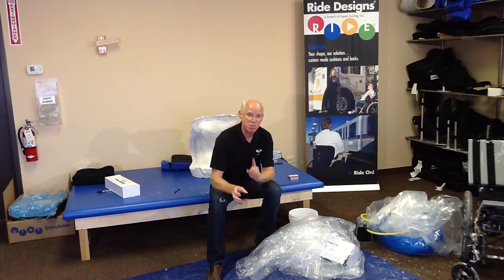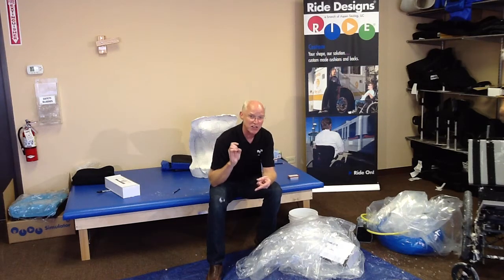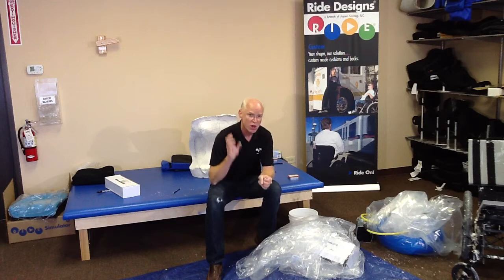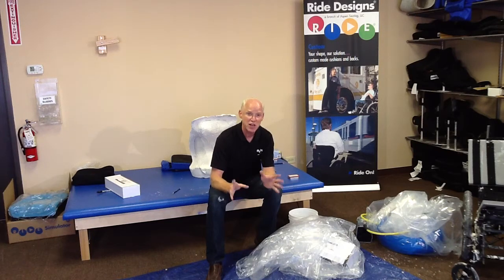The main challenge with getting systems out of here in a timely fashion is the absence of complete information when the shapes come into us. So please get us pictures and complete information. That'll go a long way towards getting us quickly through the production process and get the ride custom cushion back to you in a timely fashion. Once it's dry, I can remove the plaster from the bag, I can connect the dots for my trim lines, make any other special marks on the cast, set it aside, refresh the simulator, and be ready for my next client.